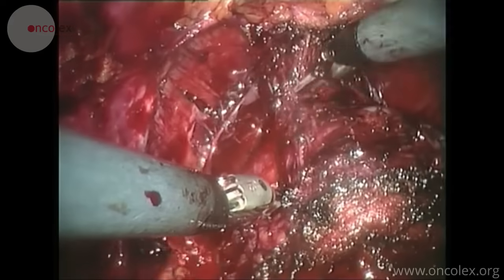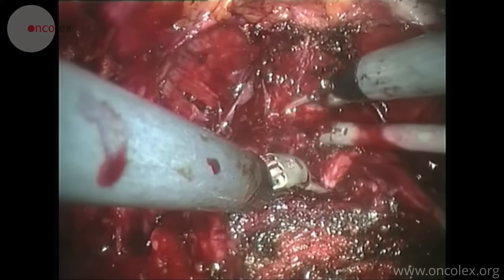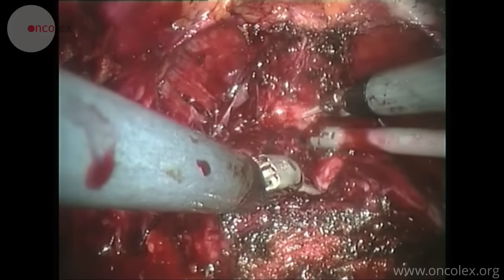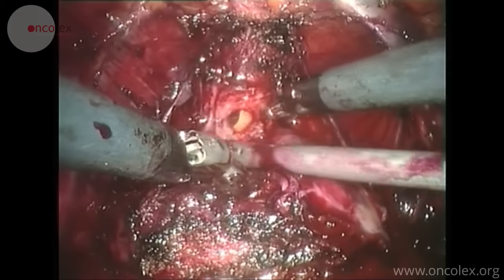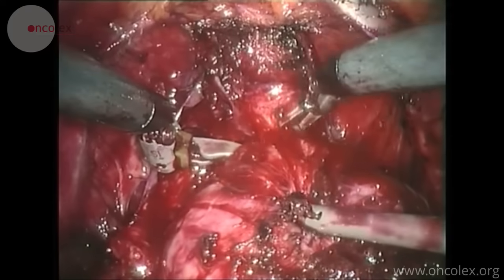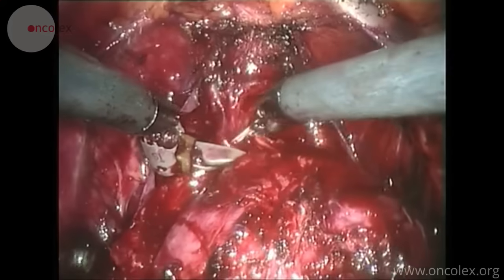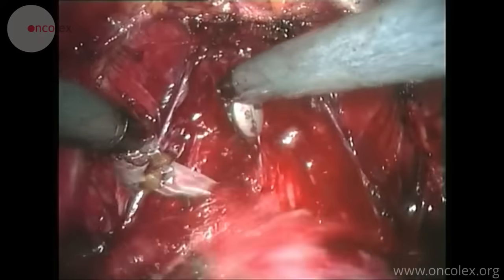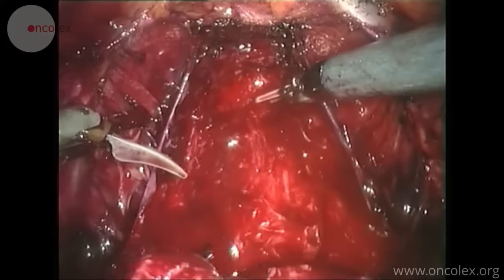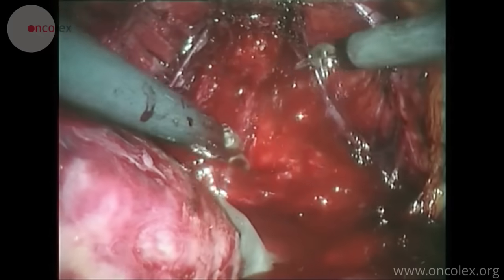The surgeon has now reached the apex of the prostate and cuts the urethra close to the prostate using only scissors and no diathermy. The posterior urethral wall is then cut and the prostate is free. The prostate is placed in an endobag and remains in the abdominal cavity until the anastomosis is finished and the surgery is concluded.